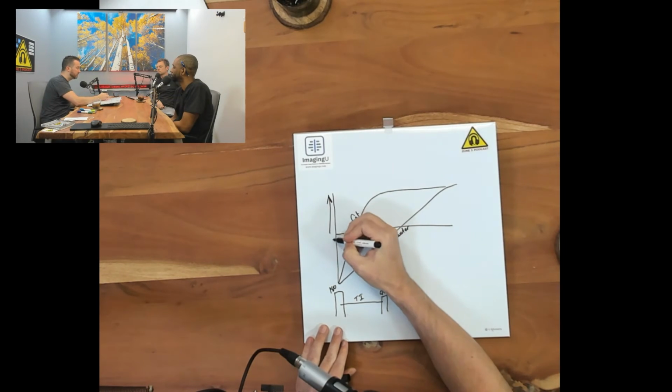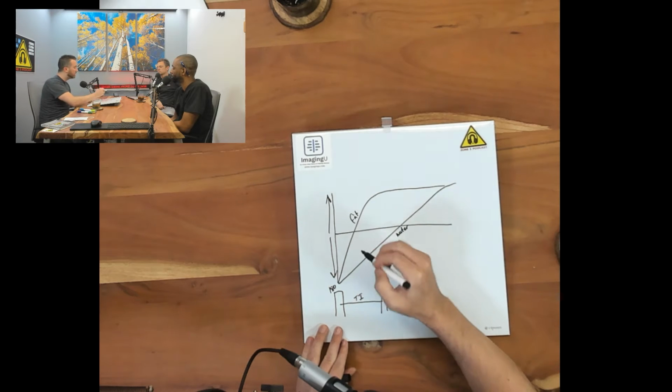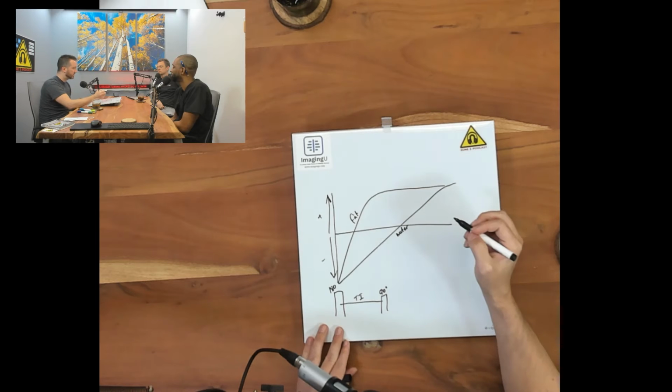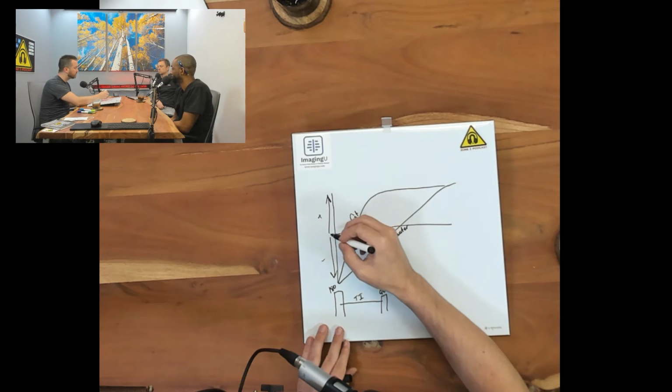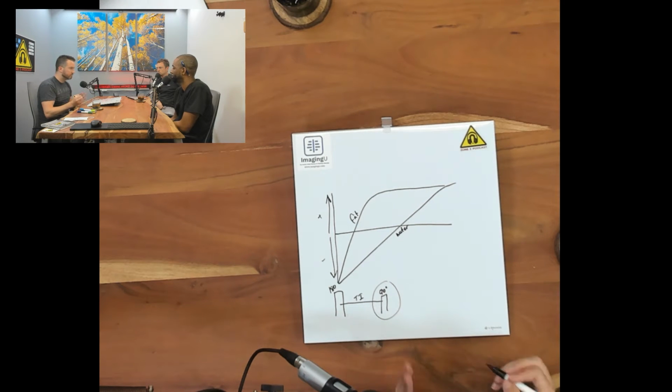Just a fun fact, only the protons that have either a positive or a negative amount of B0, so longitudinal magnetization, right? If I have either positive magnetization or negative magnetization, only those, and negative's not bad, positive's not any better, whatever. But whatever has had a chance to recover, that's the stuff that gets affected by the 90-degree pulse. And that's the big thing that I was missing, right?